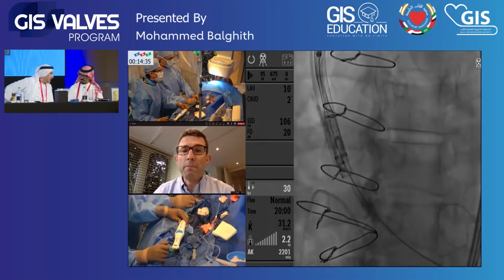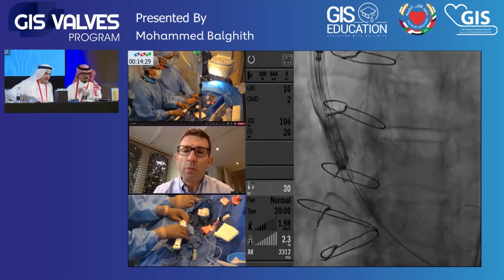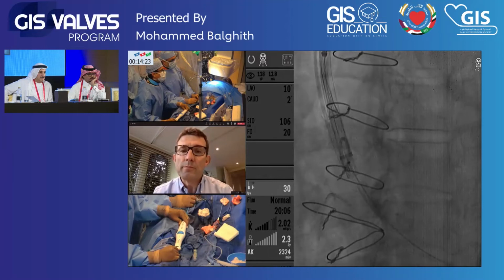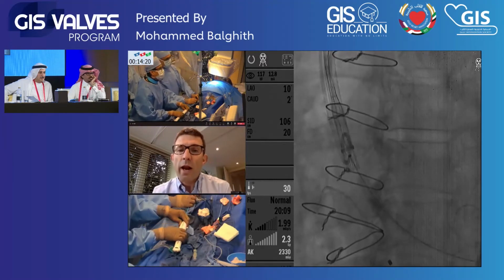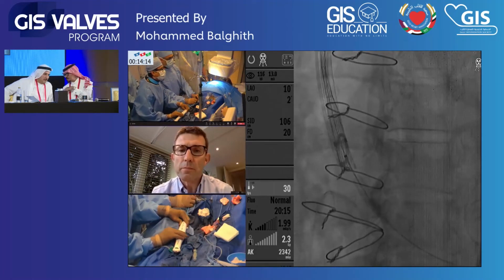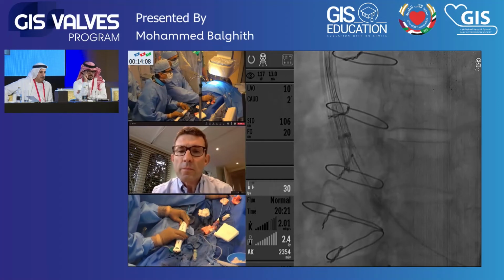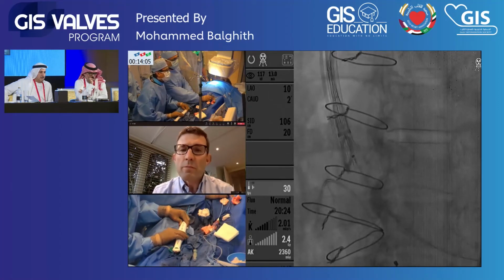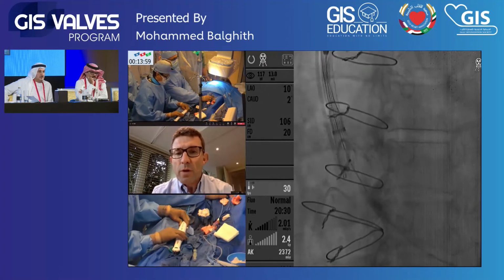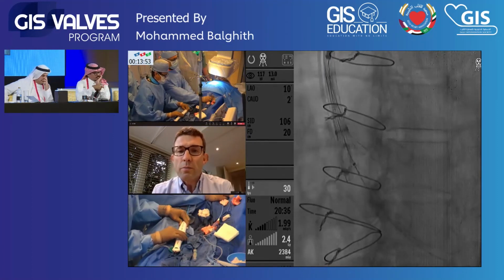Okay, angiogram, inject. We don't want movement. Little bit down. What do you think? Yeah, I think you can probably come back about 1 or 2 millimeters towards the aorta. What do you think? That's better? Yeah, that's better now. I like that. Okay. Seems to be good. Continue. Yeah. We're going to reach 50% soon. Blood pressure is stable. This is one of the advantages of this type of valve.